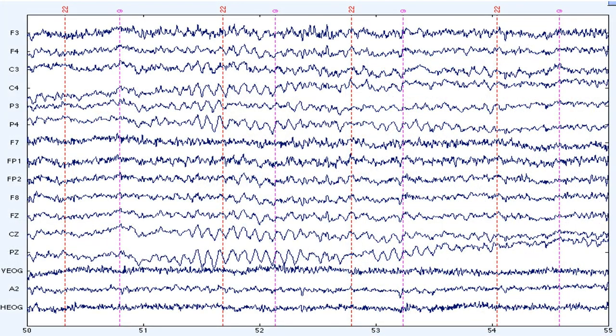Here we're looking at a 5 second period of EEG, starting 50 seconds into the recording. We get a separate signal at each electrode site. The x-axis is time. Here it's shown in seconds, but we often use milliseconds. There are a thousand milliseconds in one second. The y-axis is voltage, usually expressed in microvolts, where one microvolt is one millionth of a volt.